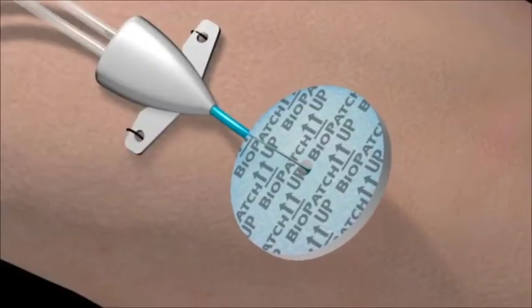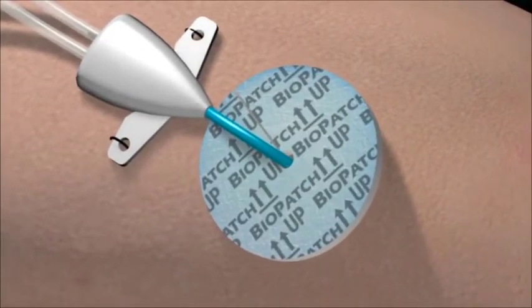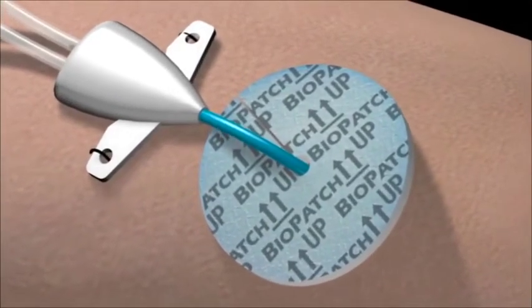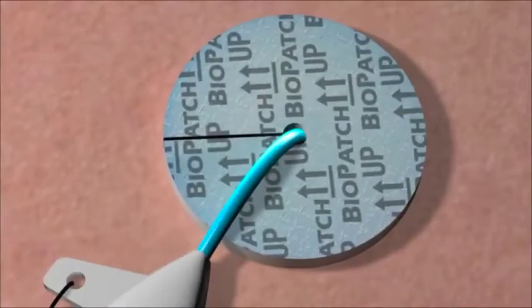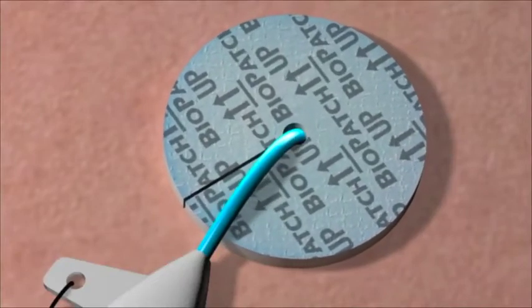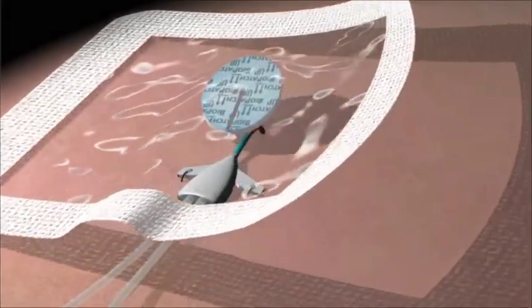Place BioPatch around the catheter or pin site with the CHG impregnated white foam side in direct contact with the patient's skin. Make sure that the BioPatch is not laying on top of the catheter hub. When aligned properly, the pre-cut slit allows for an easy release of the catheter when the transparent film dressing and BioPatch are removed.